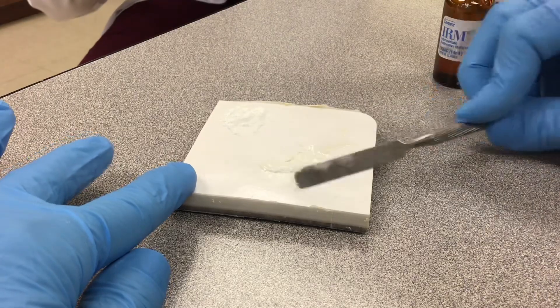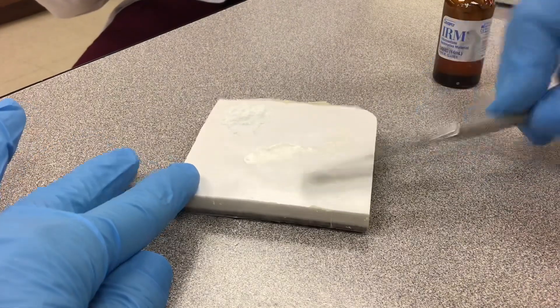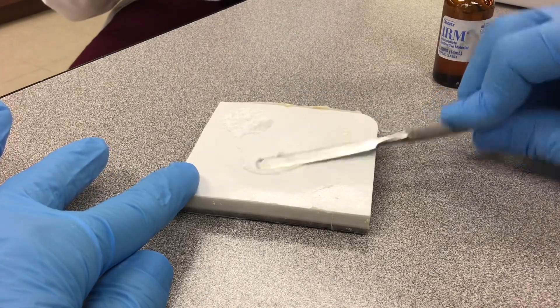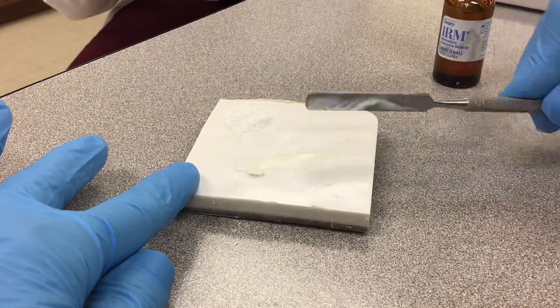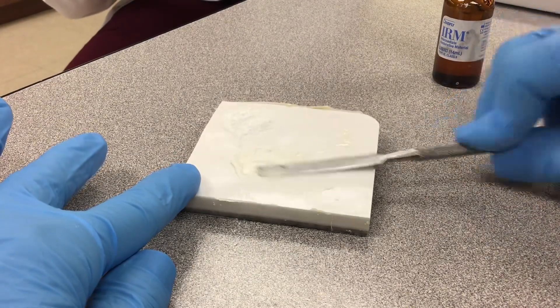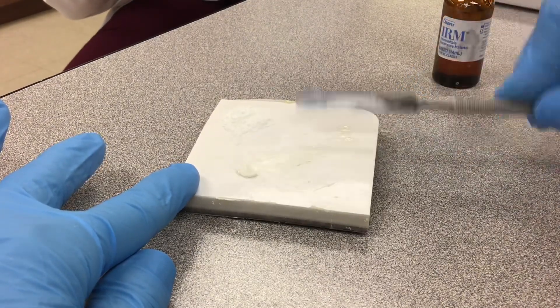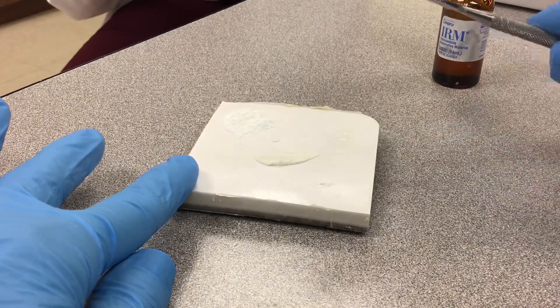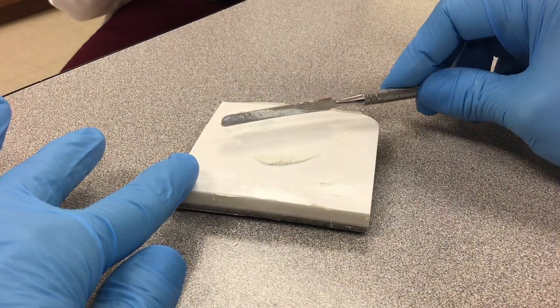Keep going. Now, if this was going to be a cement, I would say this right here — consistency is pretty good for cement. Yeah, that's pretty good consistency for cement. But what we're doing is a base fill, so keep on mixing.